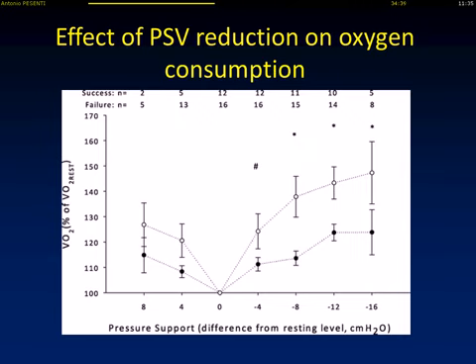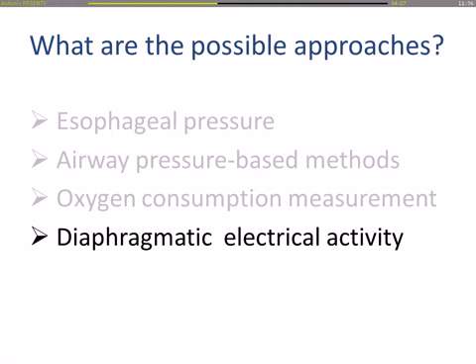It's like athletes. Trained athletes can increase their oxygen consumption very much, and they succeed. They win the game. Untrained athletes use more oxygen because they are fat, they are heavy, but they cannot increase their oxygen consumption enough to succeed. But so much for oxygen consumption. I think oxygen consumption for the time being is not day-to-day practice, even if we have ventilators that measure oxygen consumption.